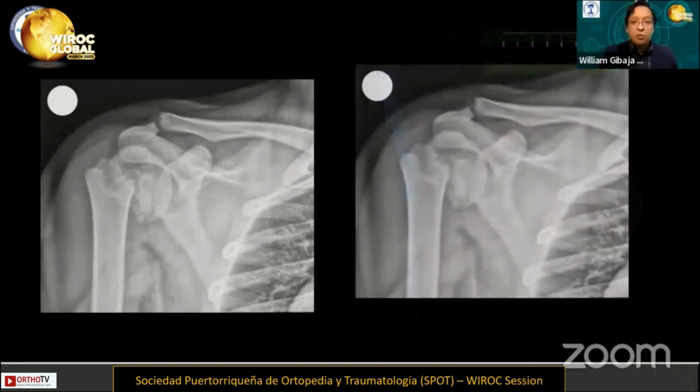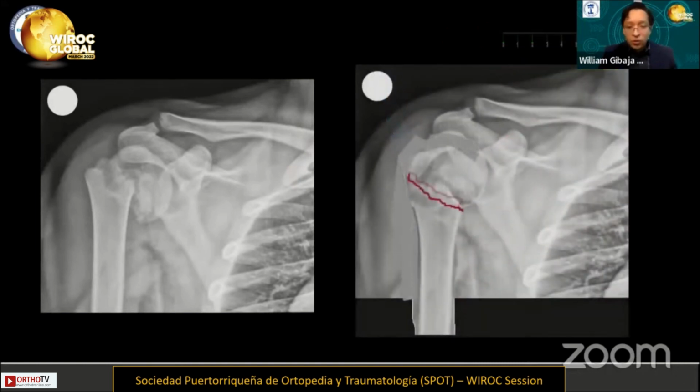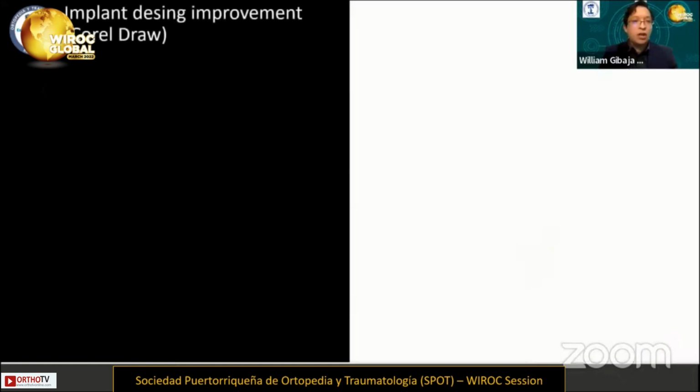And in this proximal humeral fracture, what we can do is just use these similar tools to place our implant in the exact position that we want to achieve in the surgery, and especially this E screw that we want to go as close to the calcar as possible, and see if the plate will be useful for us. Something that we've been seeing is some of the implants are not designed for the Peruvian population, but I think that will require more studies. But this is a very good idea to approach and to do everything before our surgery. Then we can add the number and positioning of the screws and do this.